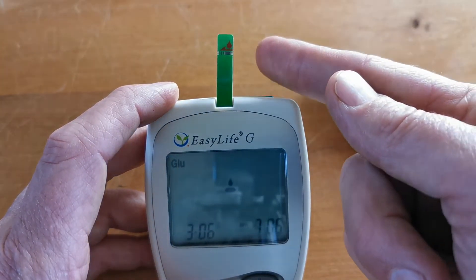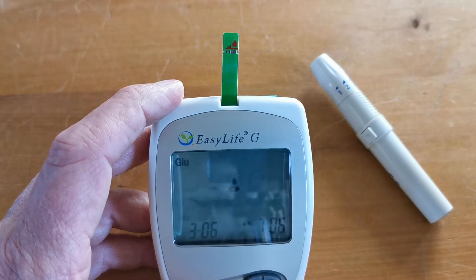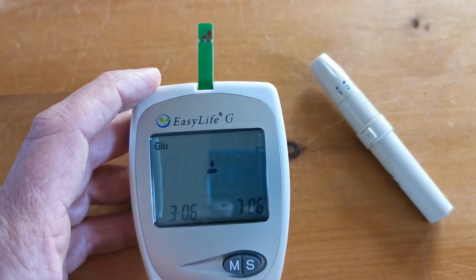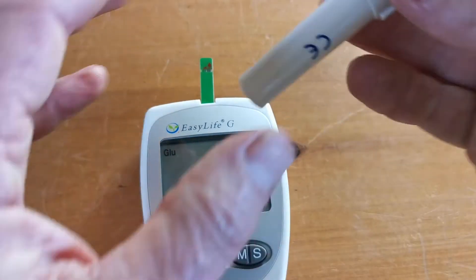So when you've done your finger prick, you apply the blood sample to the side of the test strip at that aspect. You should see blood traversing across the test strip, and as soon as an adequate sample is recorded between those electrodes, the flashing symbol will go out and indicate that you're ready to process your sample.